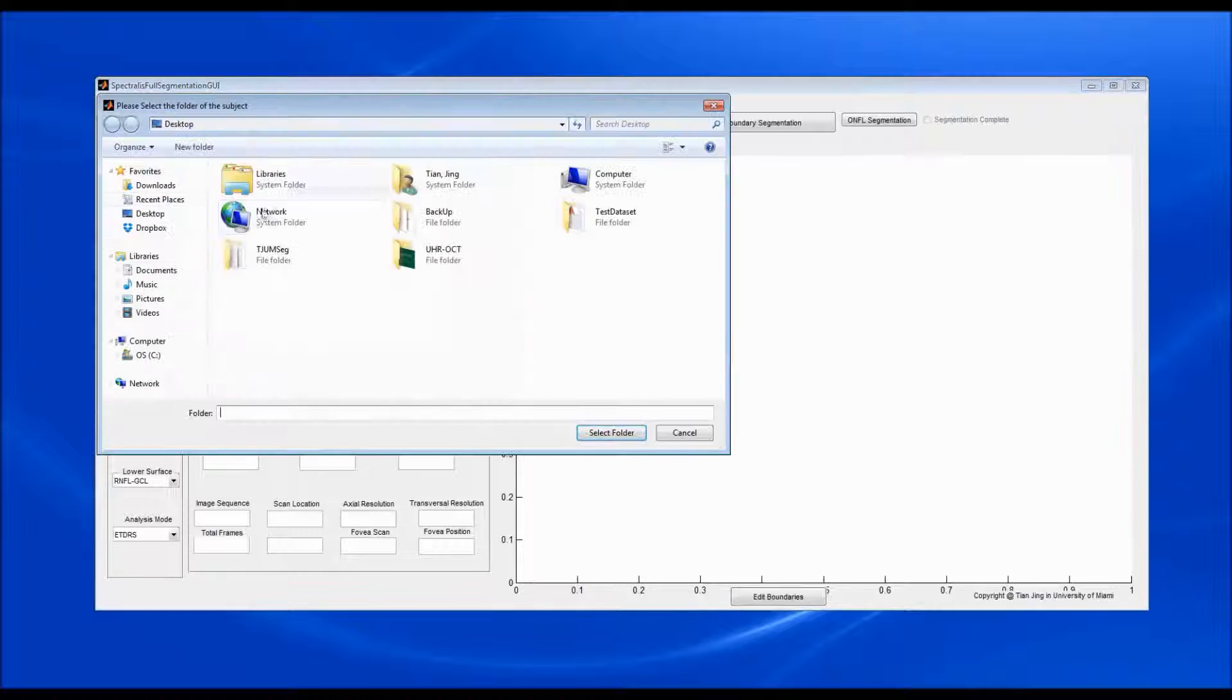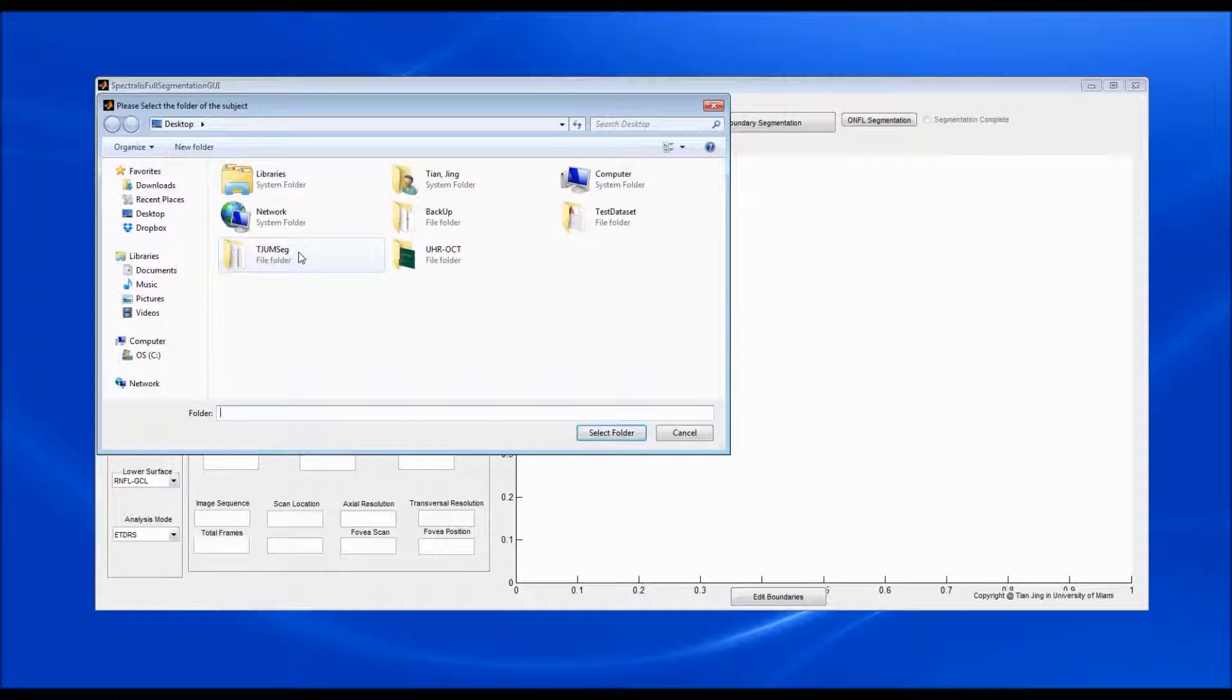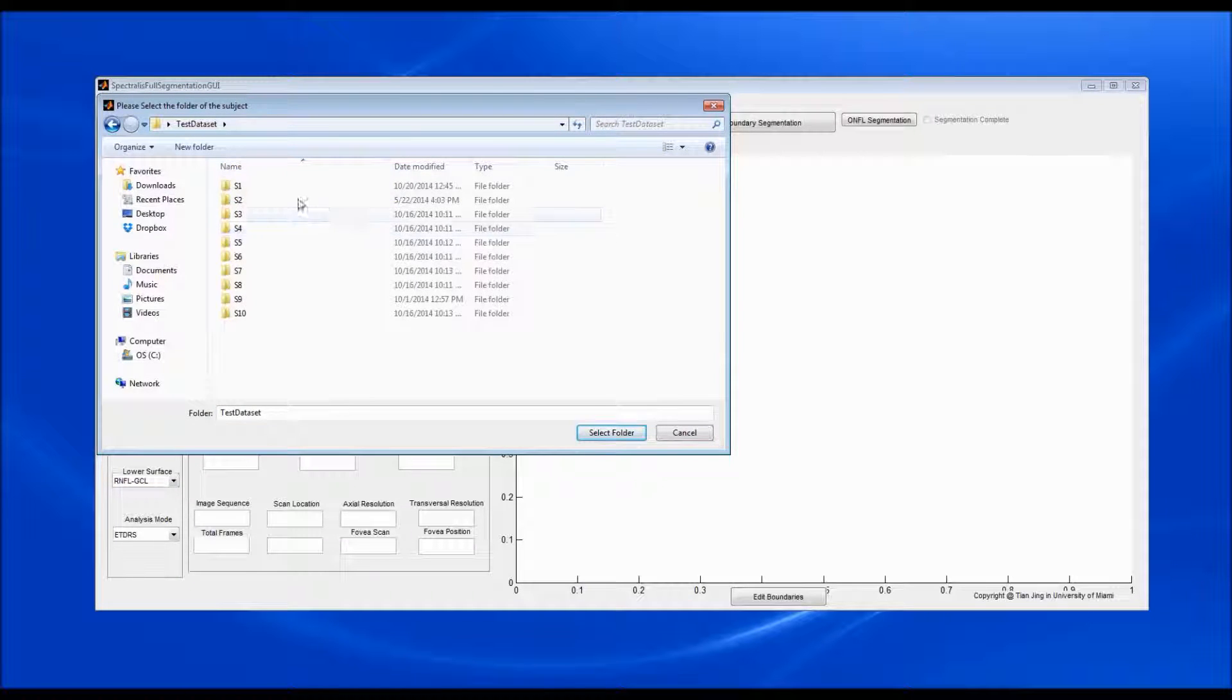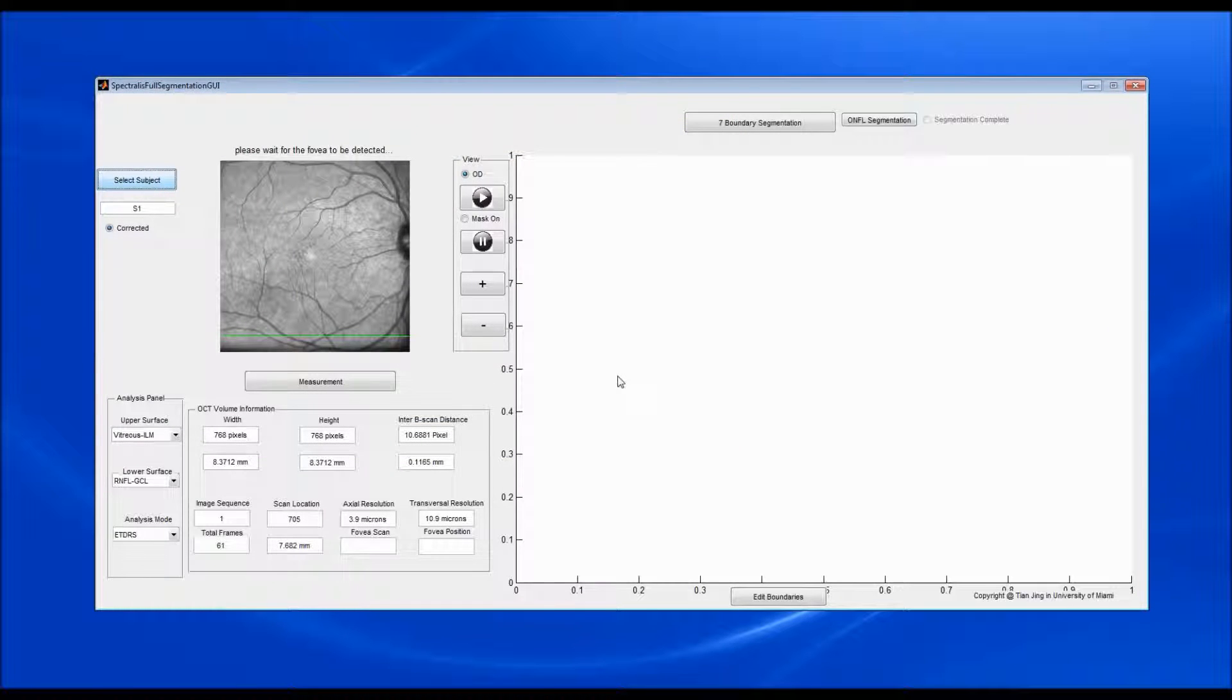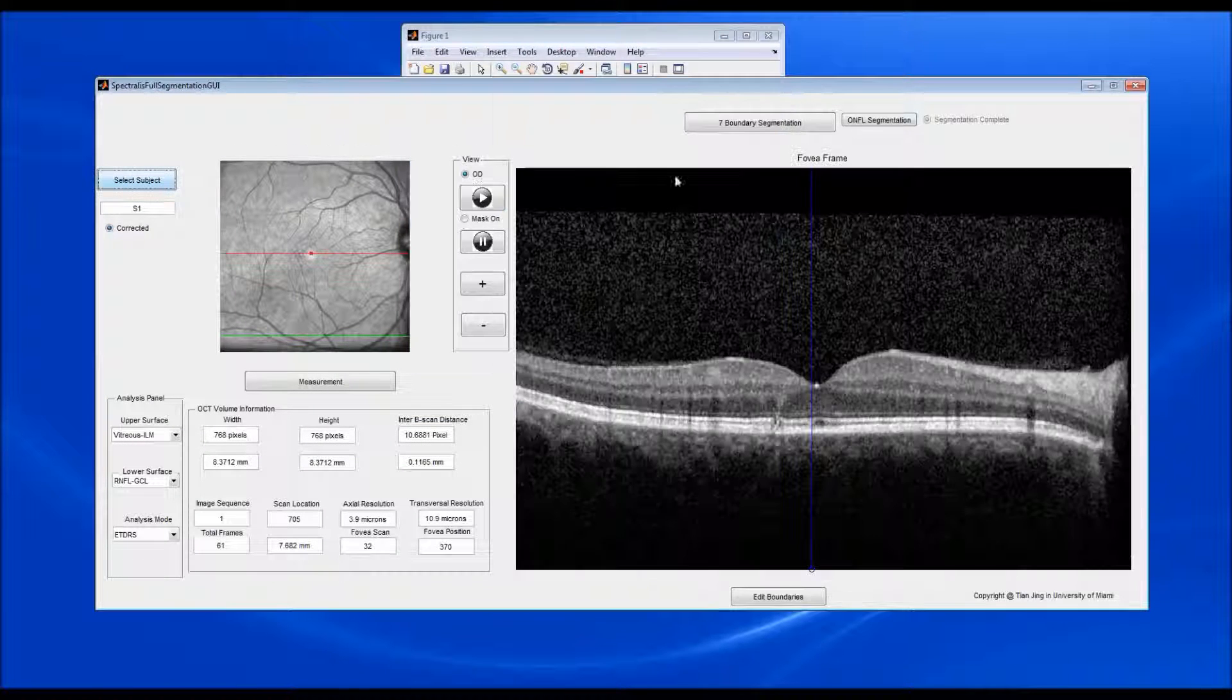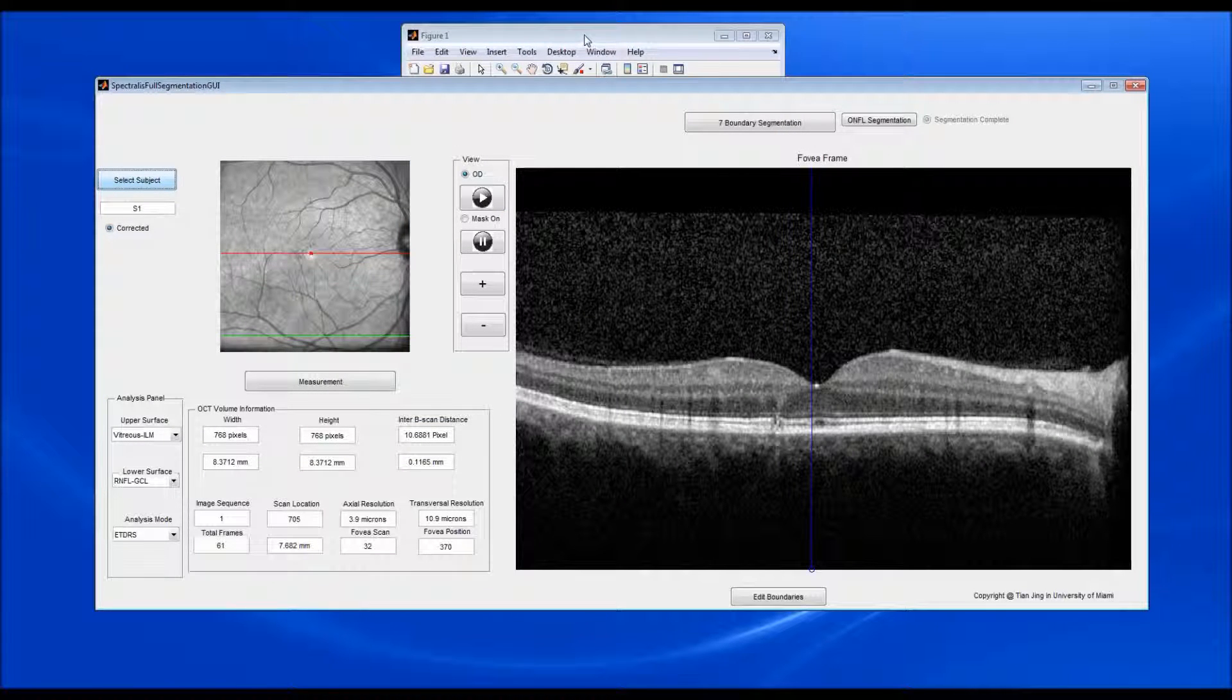Choose the patient folder. The foveal location is identified automatically.